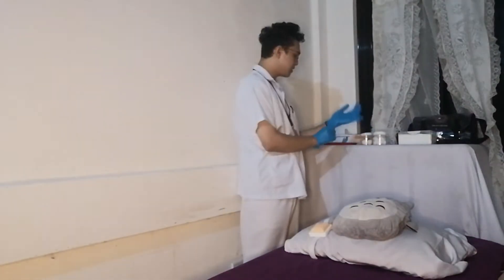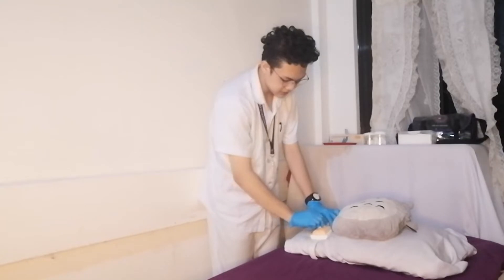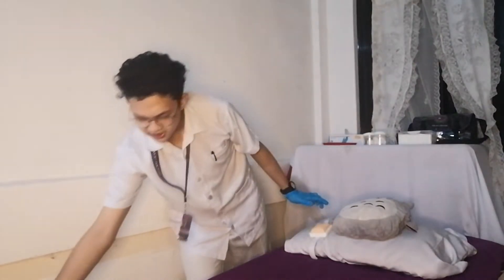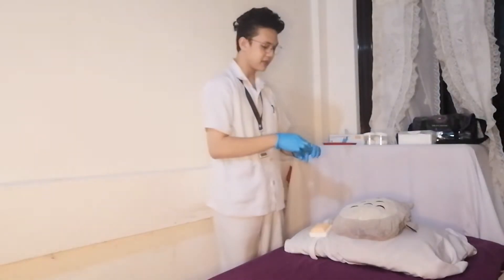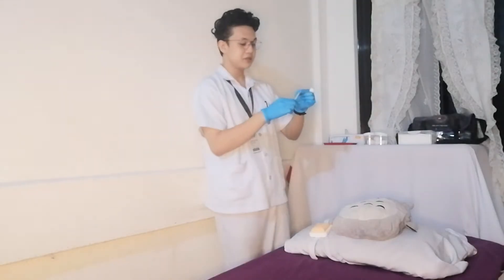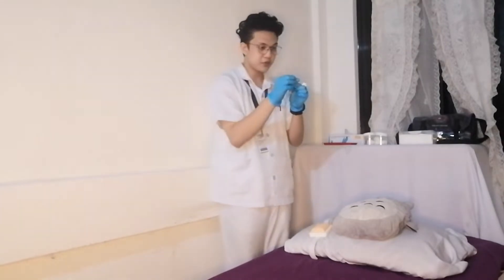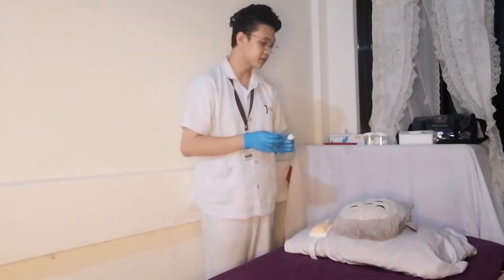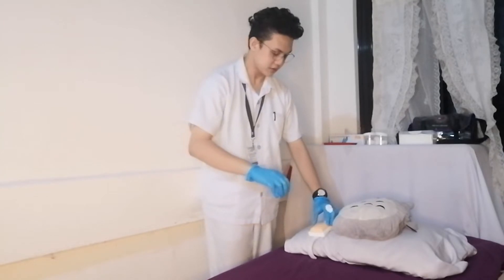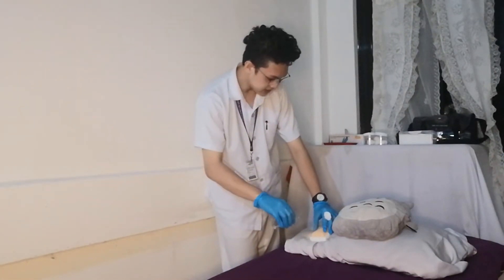I'll be using your forearm as the injection site. I'll take an alcohol swab and disinfect the area in an outward circular motion. I'll grab a dry cotton ball and prepare it for later for blot drying the area. While I wait for it to air dry, I'll be removing the cap of the needle and placing it in the proper receptacle. I'll make sure the bevel of the needle is pointing upwards for smooth entry. Since this is an intradermal injection, I will be advancing the needle just below the epidermis at a 5 to 15 degree angle.